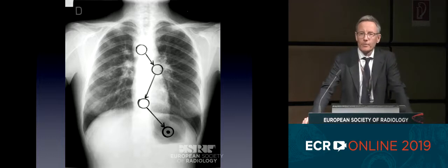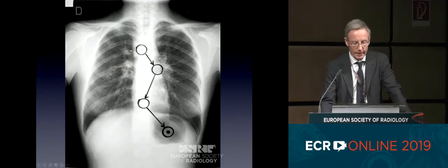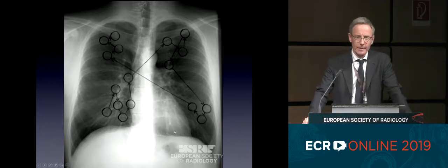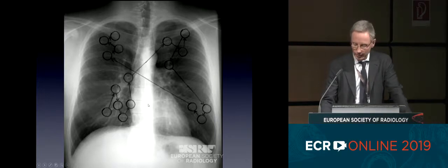Now, eye tracking studies were performed right through the 1970s through to the 1990s, looking at how different categories of persons and physicians and radiologists report and review images. On the chest x-ray, if you ask a novice to look at an x-ray, they will show some interest to the white area in the middle and have their eye attracted by this black area, which is the gastric air bubble below the diaphragm. If you ask a medical student to look at a radiograph, they may have had some tuition during their studies. They will have learned that there are some areas of importance to be looked at, maybe up at the upper regions of the chest, perhaps one of the hilar, and they have an idea that it's important to look at the bases too.